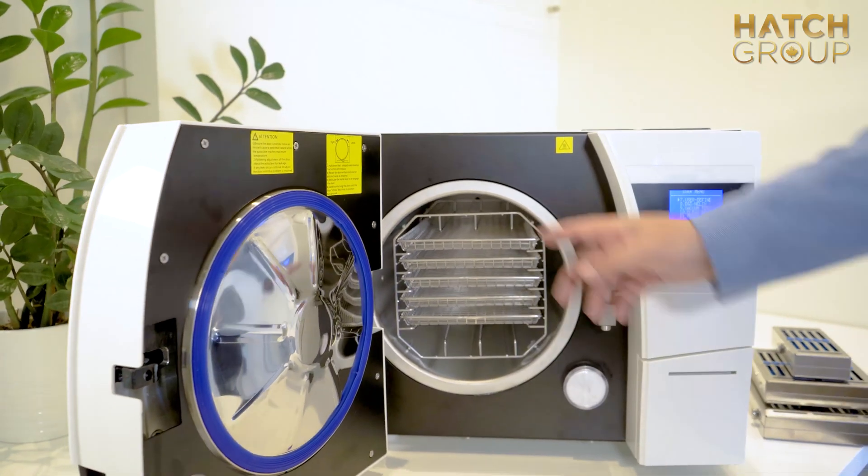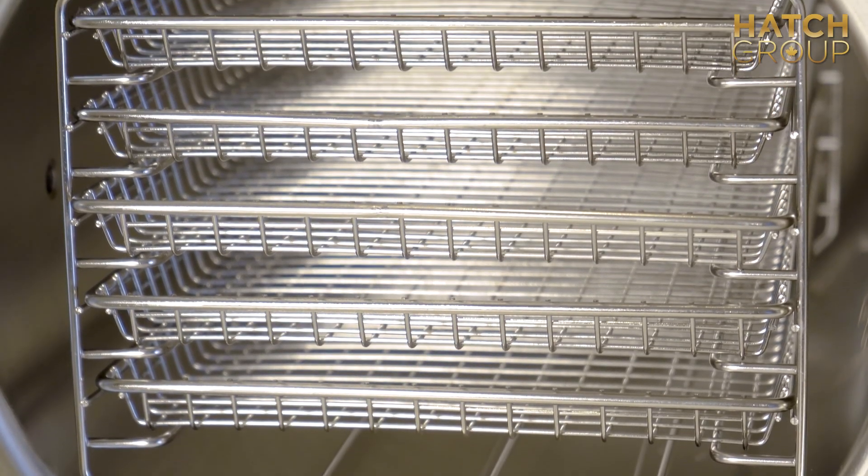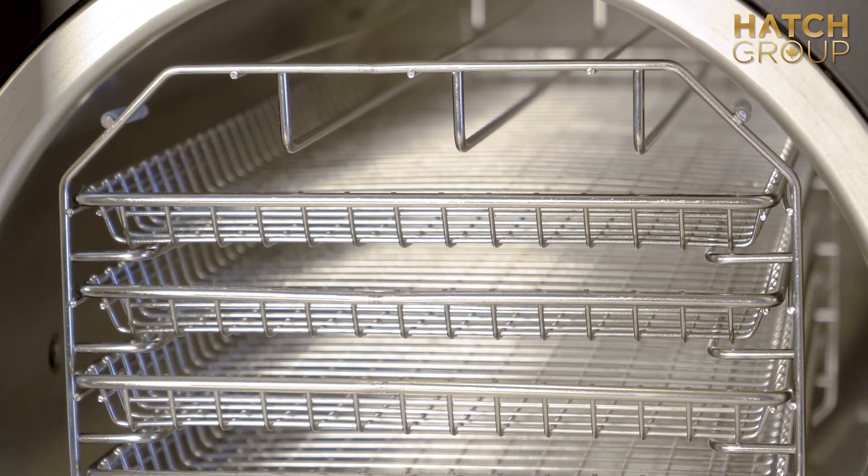Inside the chamber, it comes standard with five trays, as you can see. And if you want, you can go ahead and take them out and put cassettes in.